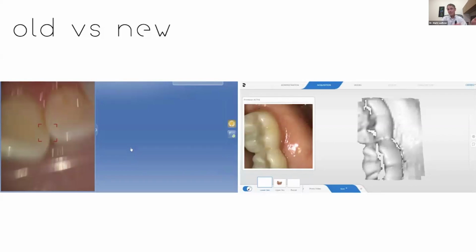You compare and contrast that and come forward 10 years, you see the scanner on your right with the gray screen here. The scanner on the left is us scanning, having scanned forever, doing the very best job that we could as quick as we could. Versus if you look here on the right, this was a dental student. This was his very first scan ever.